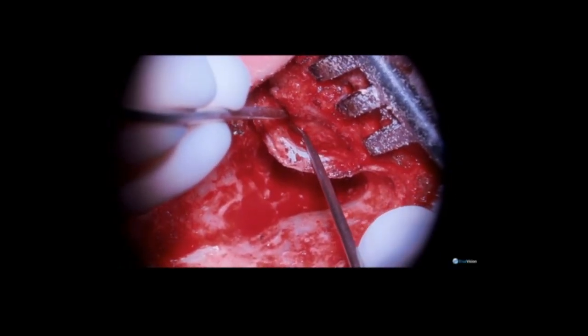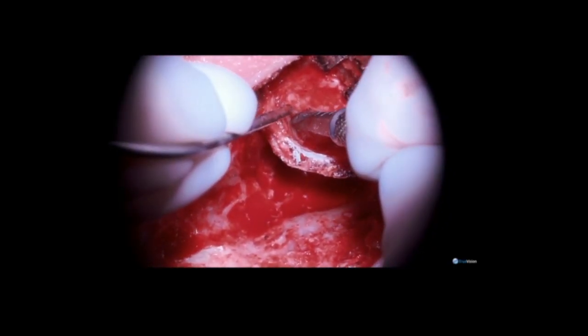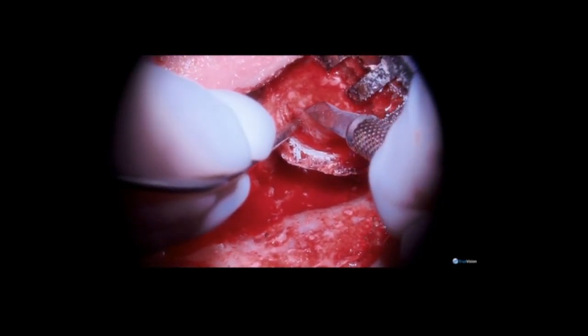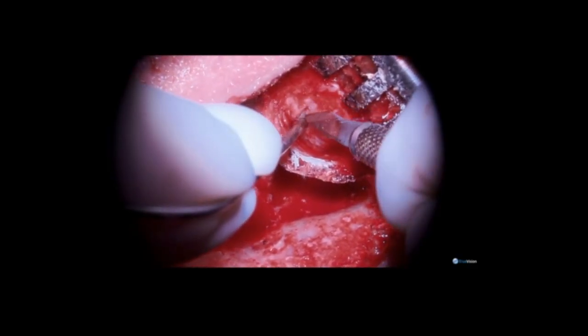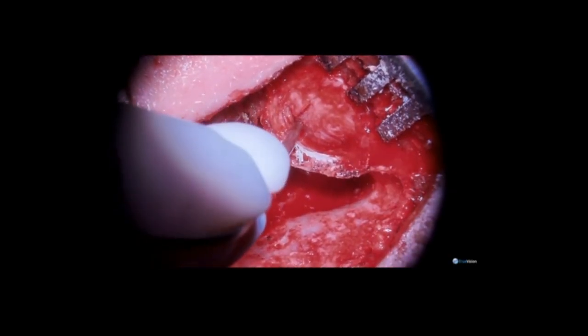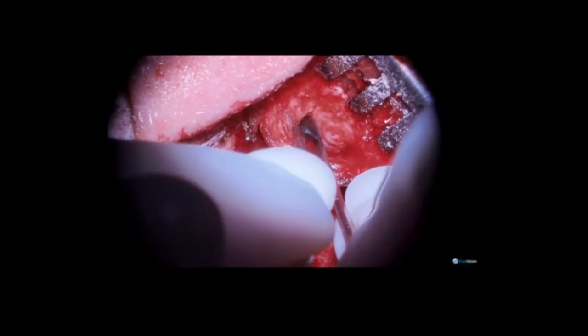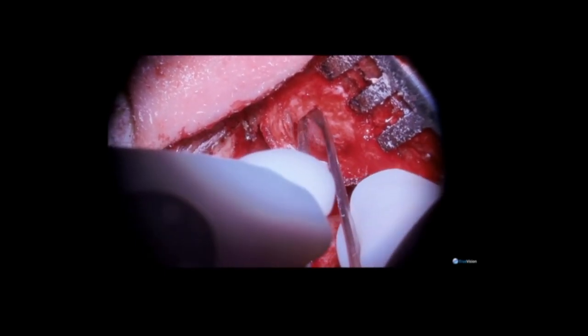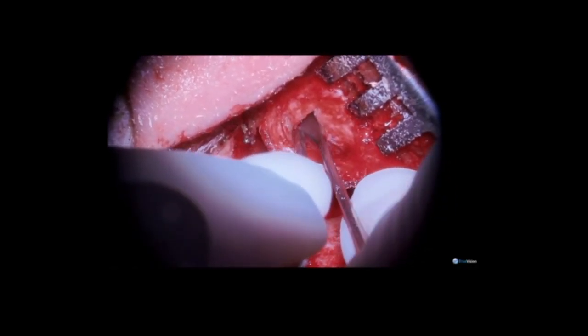Prior to entering the external auditory canal, however, I'm going to carefully incise and elevate the communication between the tympanic ring and the temporal bone, and then perform a limited anterior canalplasty so that I can get ample access to the anterior superior extent of the tympanic membrane's communication with the cholesteatoma neck.